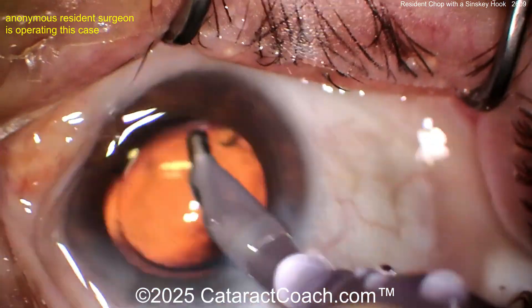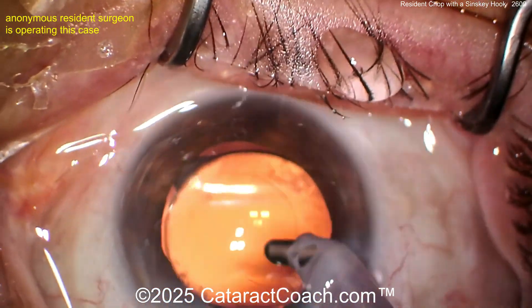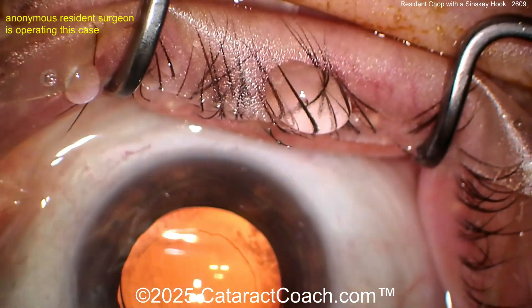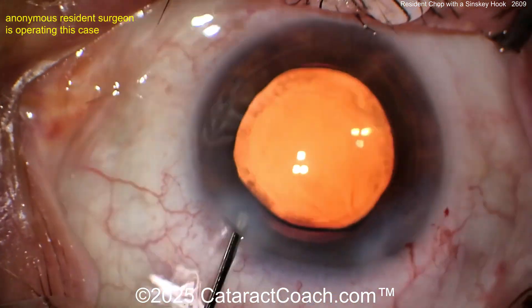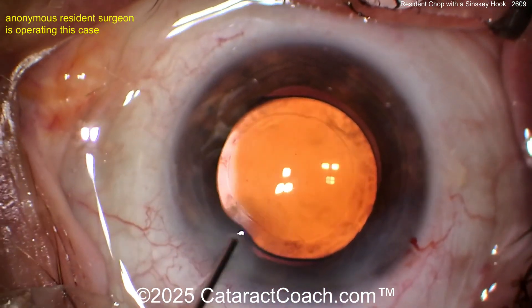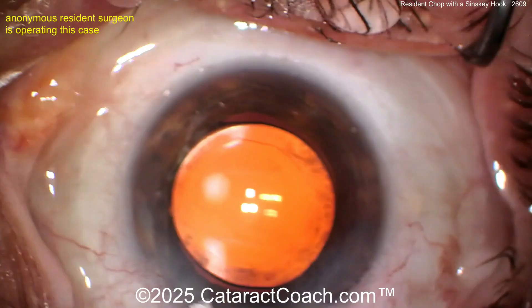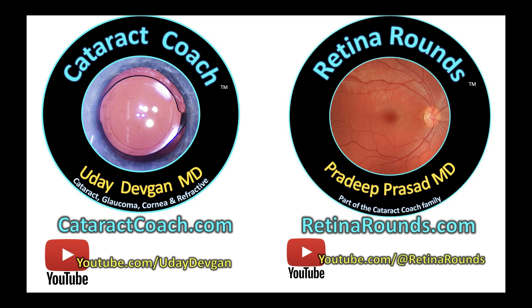Make your incision a little longer into the limbal vessels — a little longer tunnel length — but even as it is, it's still a pretty reasonable incision. No major faults in this case; you did a beautiful job. I encourage our young listeners: the onus is on you to push yourself to be a better surgeon. If you want to practice in my neighborhood, you're competing against me — so work hard. Check out retinarounds.com; you're going to love it and learn a ton.